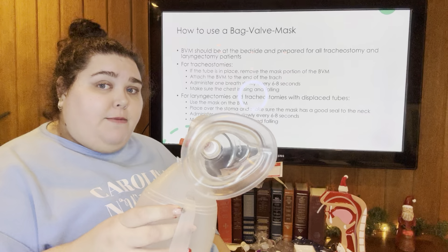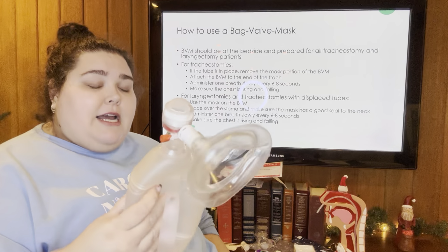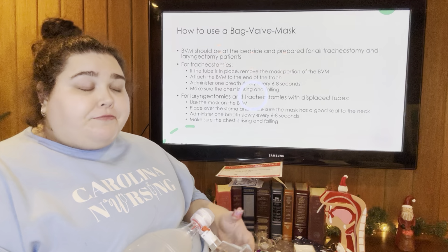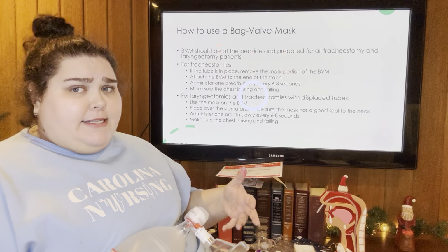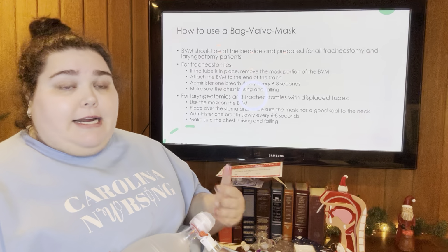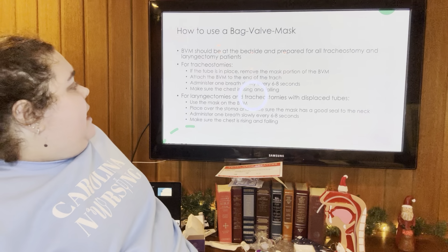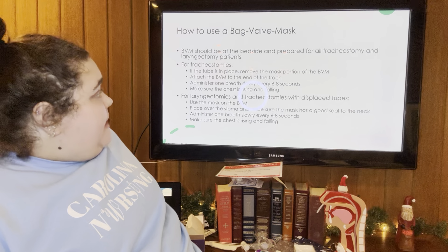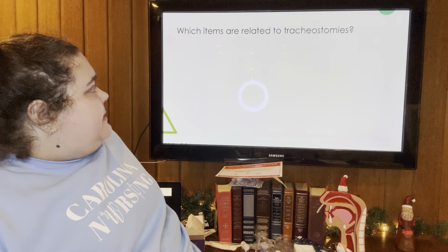You want to do it over a couple seconds, nice and slow, enough that you're seeing the chest rise and fall. And you want to do 8 to 10 breaths a minute. So that's every 6 to 8 seconds. And then, yeah, so that's your bag valve mask.